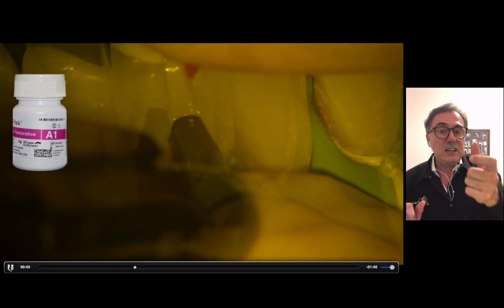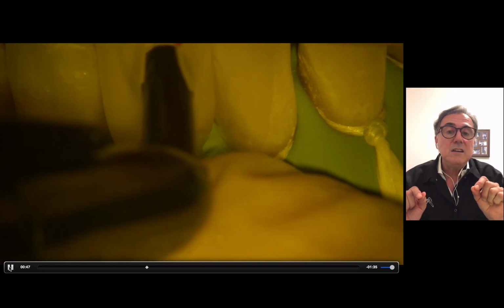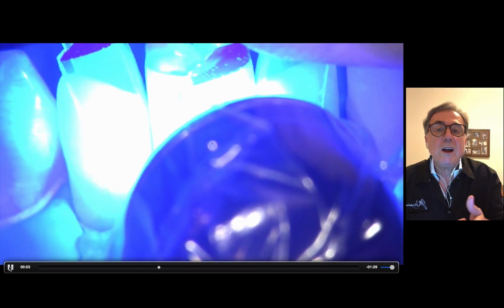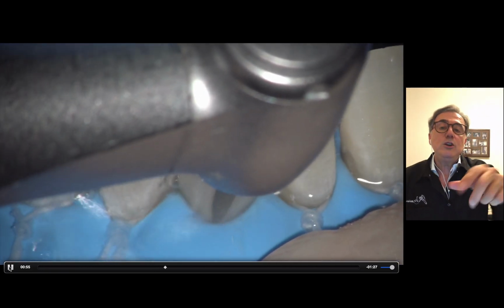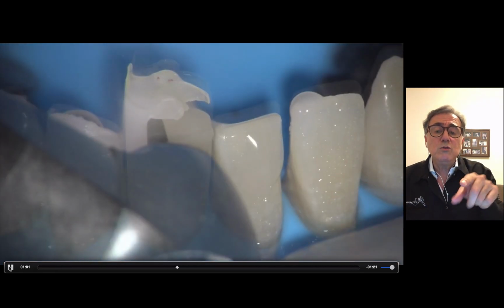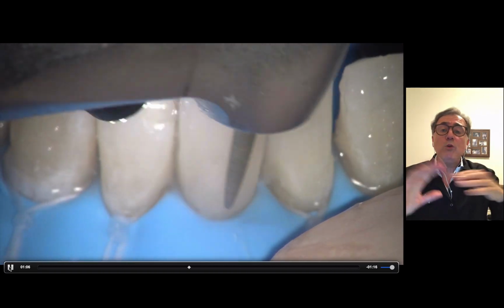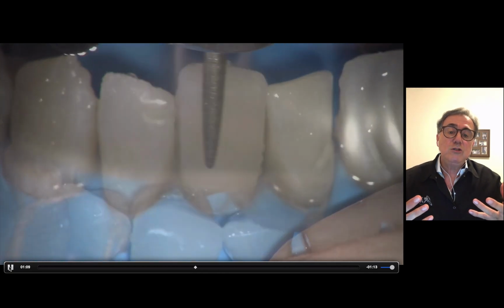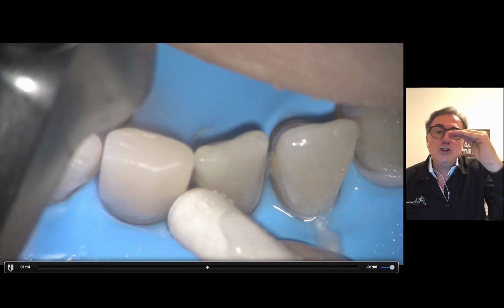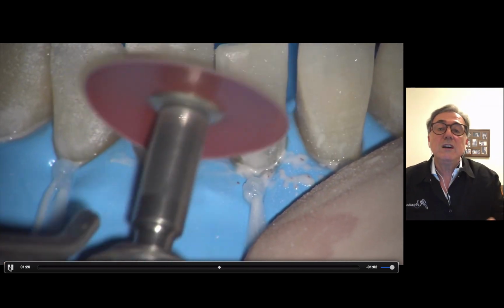So first I injected the flowable composite, and now the restorative composite, both of them heated, so it flows easier. After that you fully polymerize all surfaces, and then you remove the matrices. After removing the matrices, you're going to use your handpiece to remove most of the excess of the restoration. You just make your restoration a little bit higher than it is going to be at the end, so that you can check the occlusion properly after removing the rubber dam.